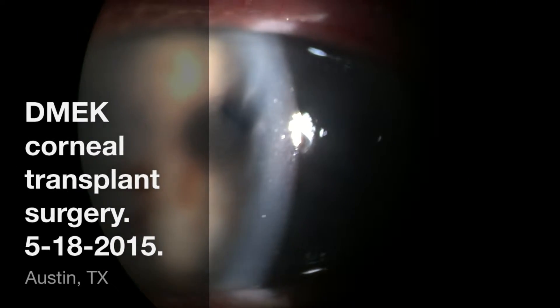Hi, this is Dr. Shannon Wong in Austin, Texas. I'm going to describe my early experience with Descemet's membrane endothelial keratoplasty, also known as DMEK.